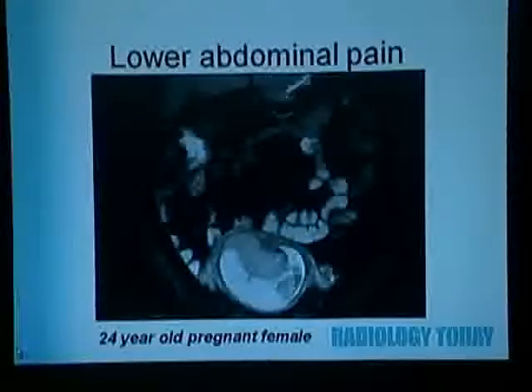And often we'll do this examination, which is a tailored MRI. The tailored MRI is done without gadolinium contrast because of fears of it crossing the placental barrier. It's a relatively rapid test. The radiologist will check the study and also do additional sequences if necessary. So here we can see low in the pelvis that there is the gravid uterus.